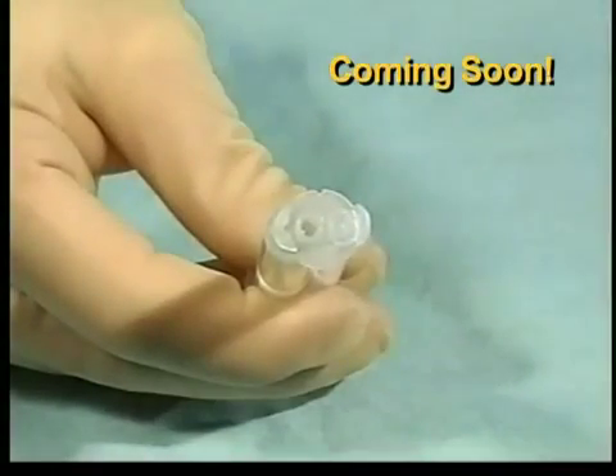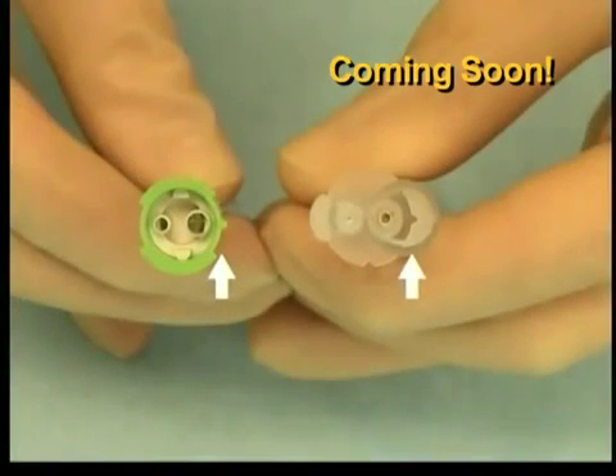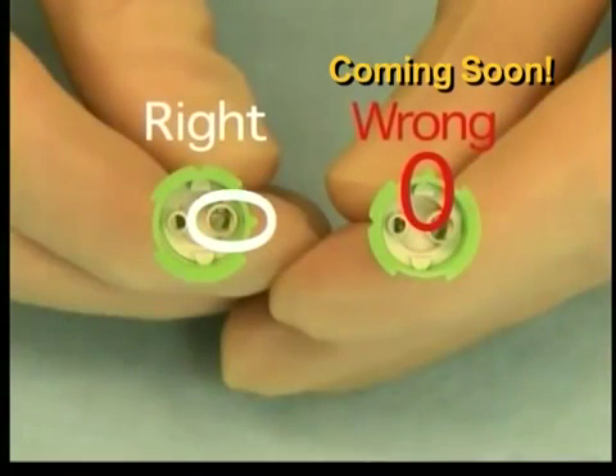Now you are ready to attach the spreader applicator tip to the syringe. Take care to align the triangular notch on the collar of the spreader tip with the corresponding notch on the nose of the syringe. Note the green collar of the spreader tip — this color makes it easier to align the collar notch with the nose of the syringe. The notch must be aligned with the large interface to assure proper attachment.